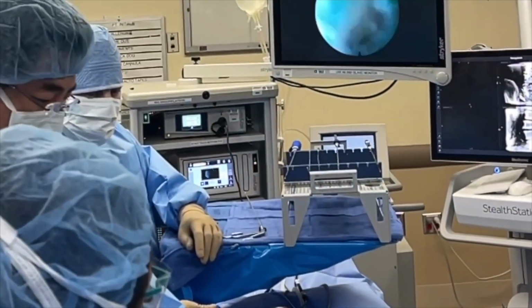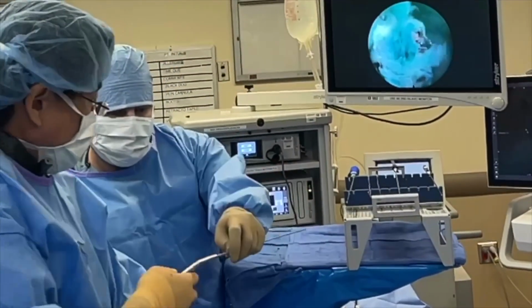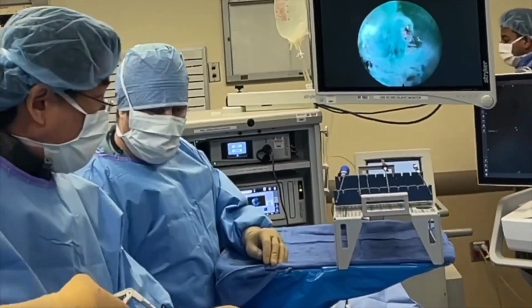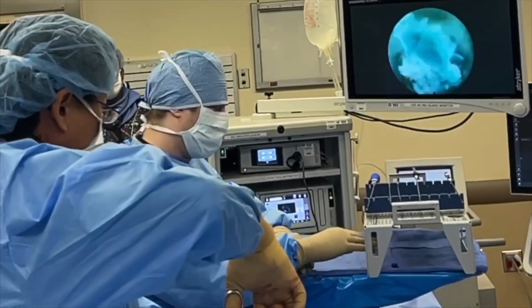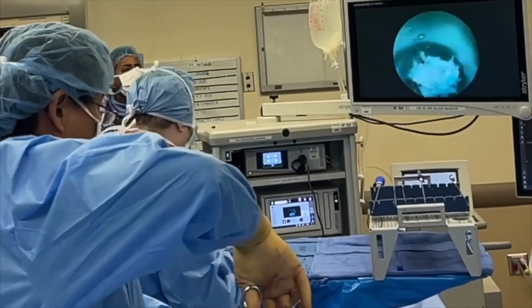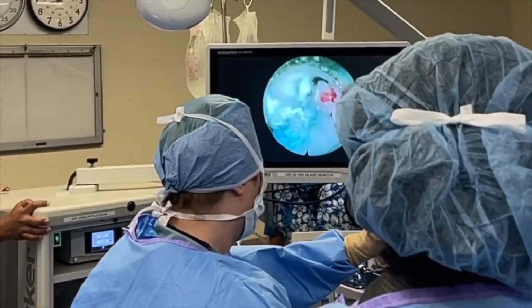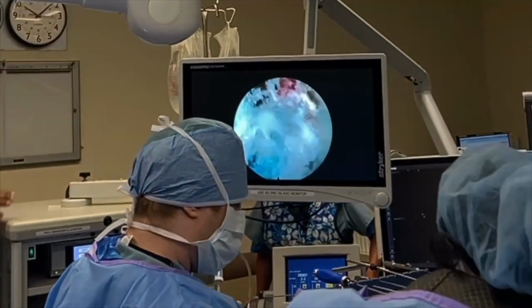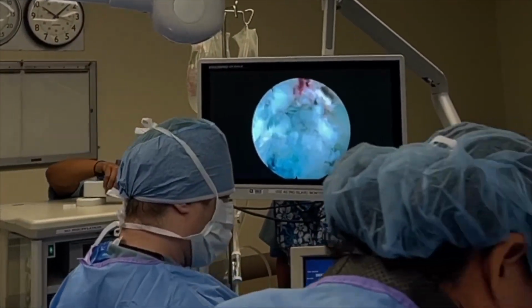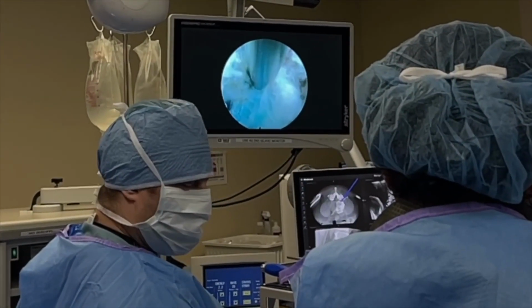Well, this is why we use the blue dye, because it's pretty. My favorite tutor. And without it, everything looks like a nerve. And when I do surgery, everything is a nerve until proven otherwise. This pretty much tells me it's not a nerve. Look at that arch right there. That's the bony window that I created with my various reamers. And you can see how medial I am to that facet joint.